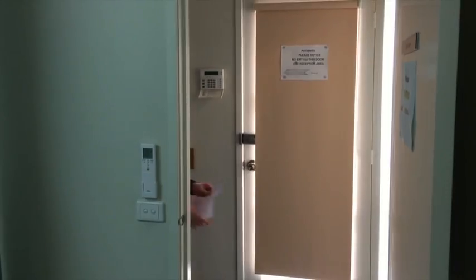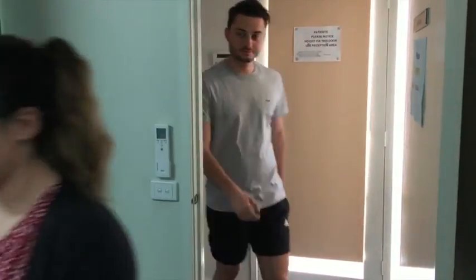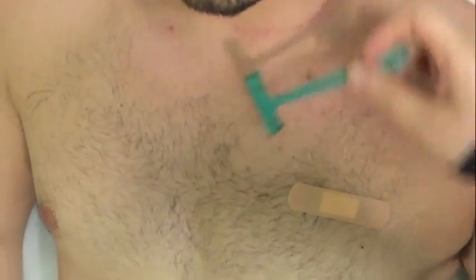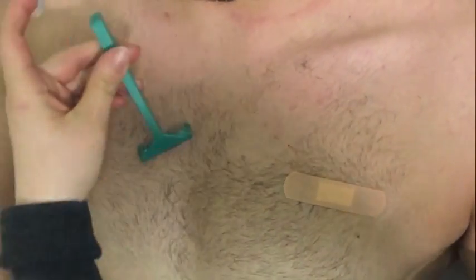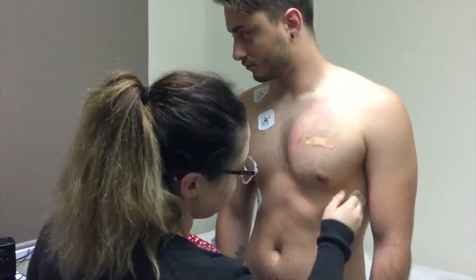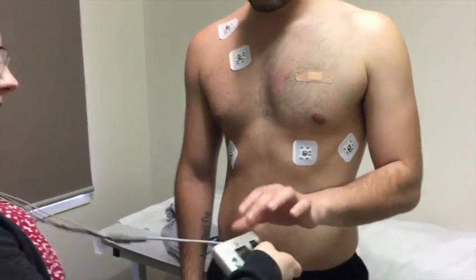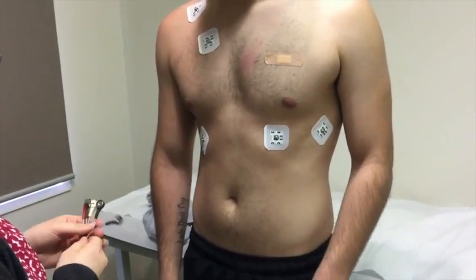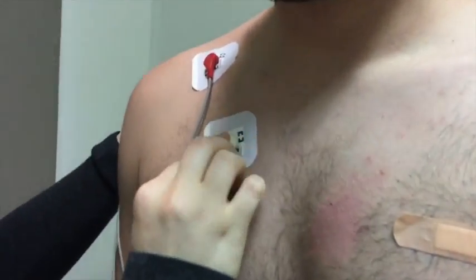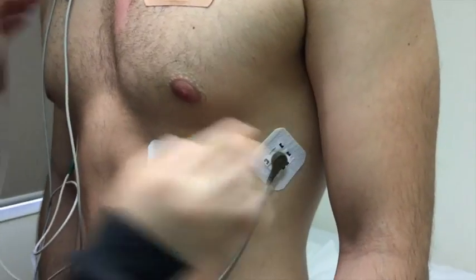When you come to Heart West for a Holter, a technician will take you to the Holter room. He or she will then place electrodes on your chest — some hair may need to be shaved to make sure the electrodes stick properly. The electrodes are then connected to a recording device with several wires. You will be shown how to properly wear the recording device so that it can record data throughout the next 24 hours.